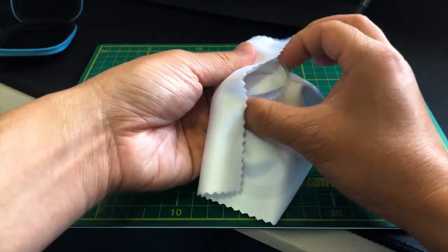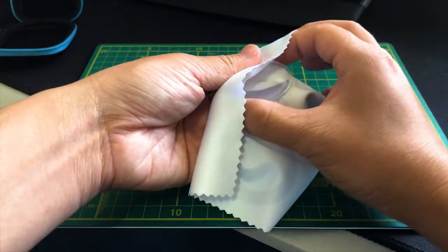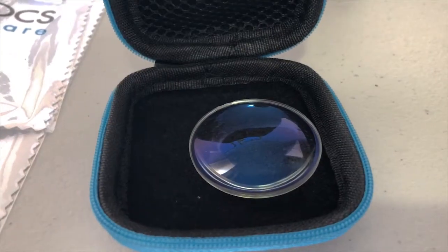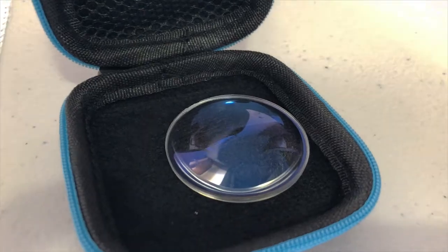It is important to keep the lens clean at all times — use a cotton fiber cloth or a blower. Now, performing the retina examination.